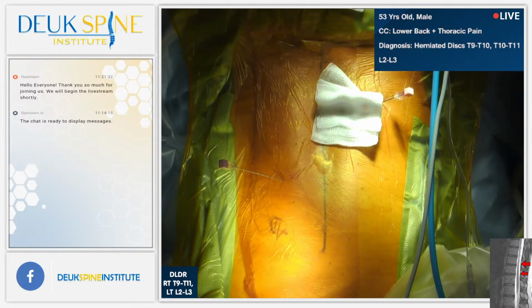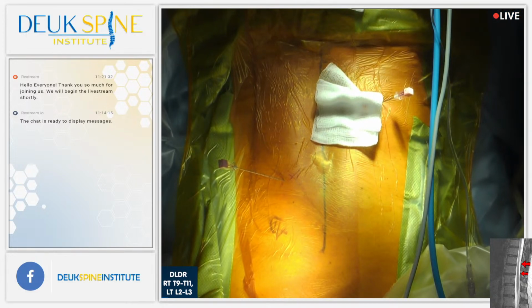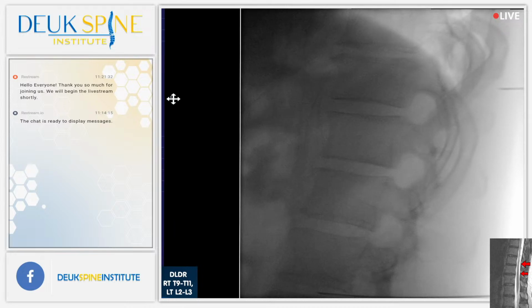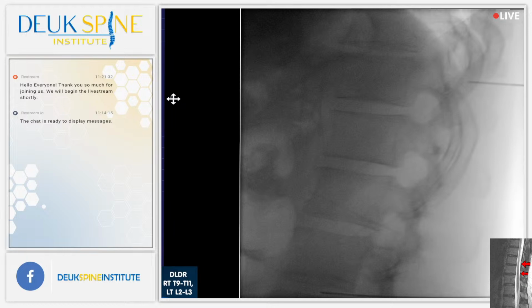All right, so there we go. So we know that's L2, L1, T12, T11. So I'm aiming for 11-12. I need to aim for 10-11. I need to be a little bit further up. Shot. That's better. Not perfect, but better. Shot. All right, so we know that's L2, L1, T12, T11, T10. I need to be a little bit higher.